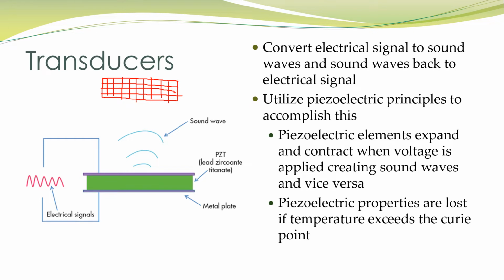Most of the time, these are made as lead zirconate titanate, by applying a lot of pressure to the lead zirconate titanate with electrical charge, and that gives it what we call piezoelectric qualities. Once it has a piezoelectric quality, when it is acted upon by an electrical voltage, it will cause that piezoelectric element to expand and contract. And as it expands and contracts, it produces a sound wave.